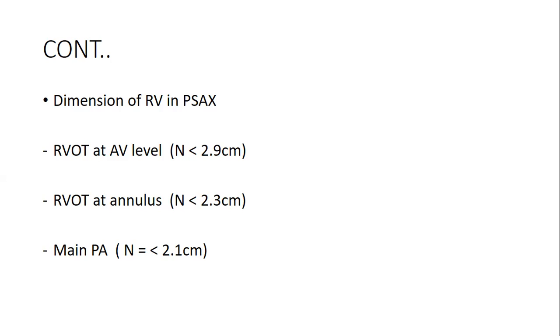I should mention again that in practice, most of these measurements we don't do them. But sometimes there is a case that is particularly requesting you to assess the right side of the heart. You have no option but to go into it and do the actual thing so that you come up with something tangible. For example, if the clinical question is to quantify pulmonary hypertension, you have to look at some of these things in detail and quantify them.